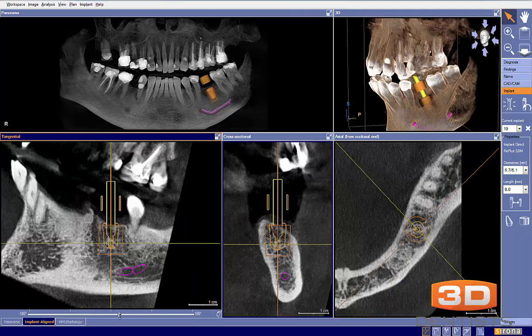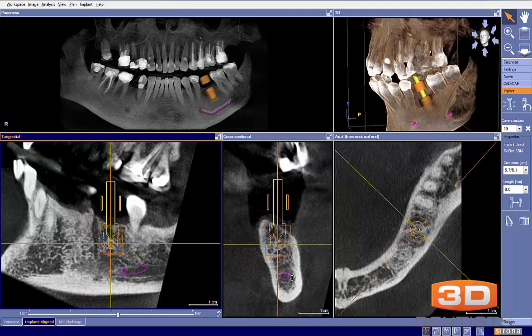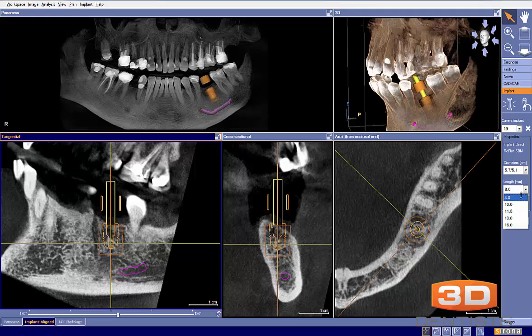Next we have vital structures. We can clearly see that our nerve is well marked and is right here, so the nerve is a non-issue. Our submandibular fossa is pretty straightforward and we've got a pretty well-defined buccal plate. So my first thought is: why do an 8mm implant when we can clearly have room for a 10mm implant? I would try to shoot for a 10mm implant.